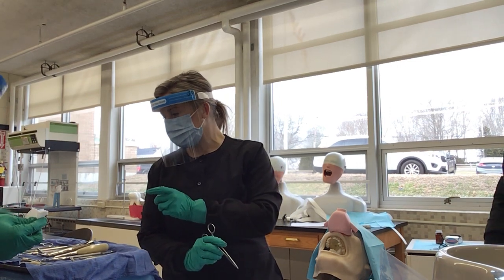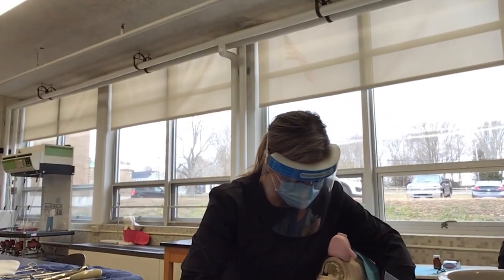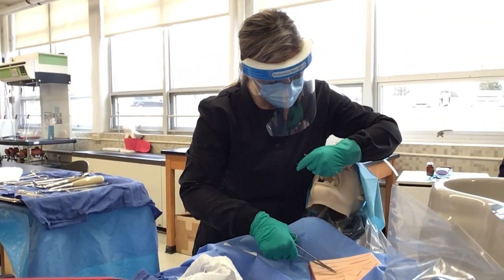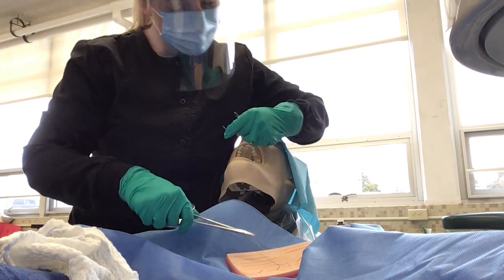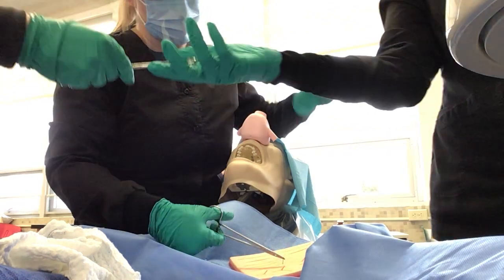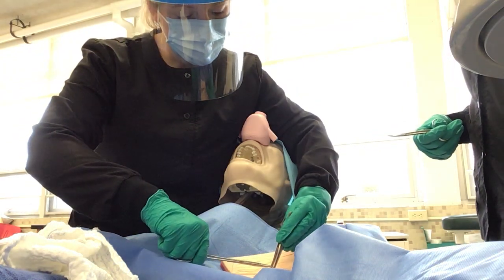So I'm going to ask for a pickup, please. All right, and then we're going to ask for the scissors. And we're going to cut. Look, it came out. It was there like that. Mm-hmm. And she's going to take that fragment. So the pickup will help hold the tissue together.